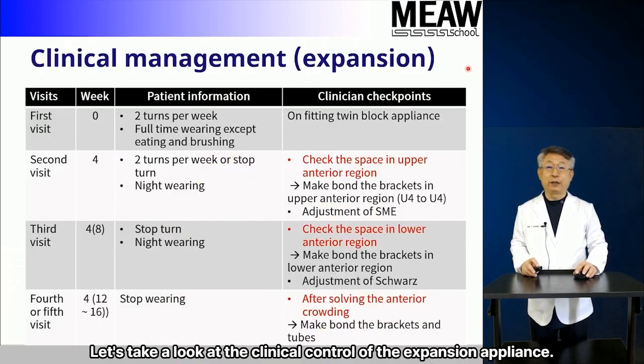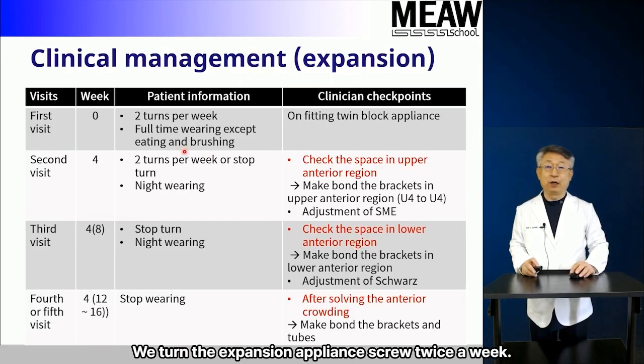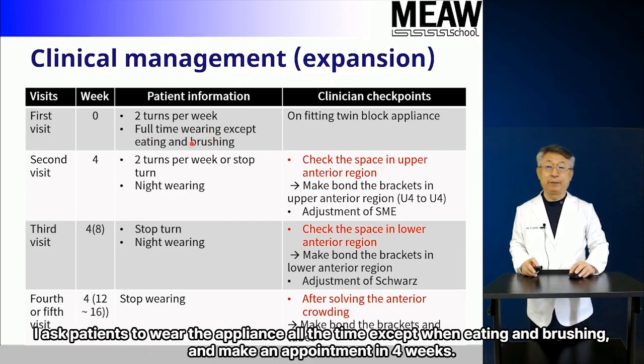Let's take a look at the clinical control of the expansion appliance. We turn the expansion appliance screw twice a week. I ask patients to wear the appliance all the time except when eating and brushing, and make an appointment in 4 weeks.